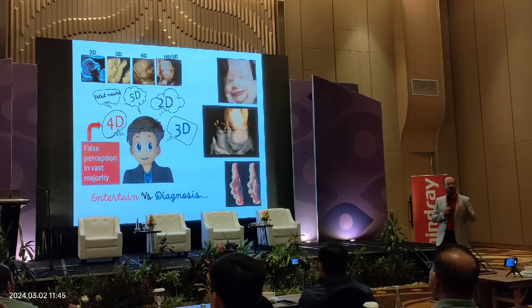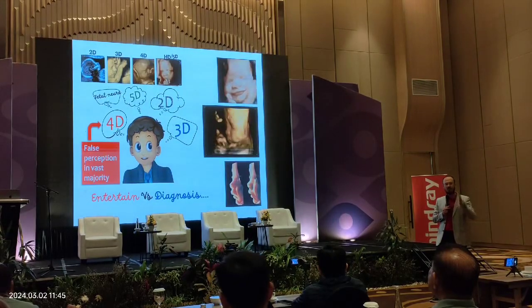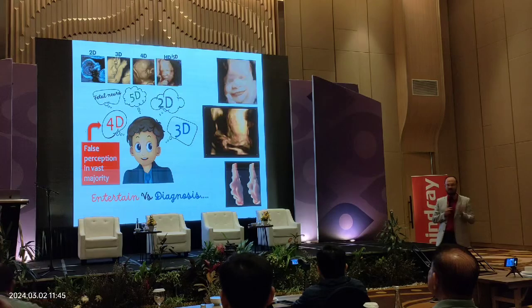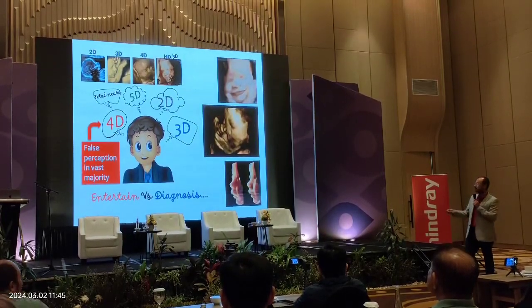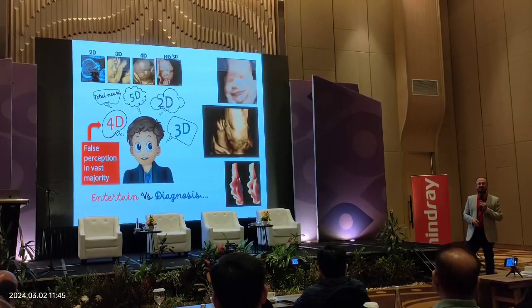We need to find out the contractility of the myocardium and the valve movement, so we can measure cardiac morphology and function. So here, I will describe three-dimensional neurosonography, and please tell the patients this is three-dimensional, and don't let them be disappointed.